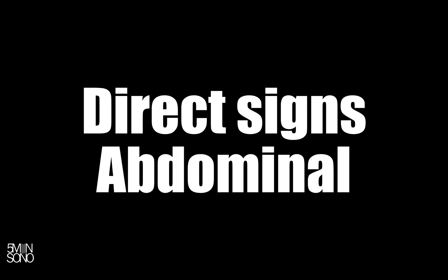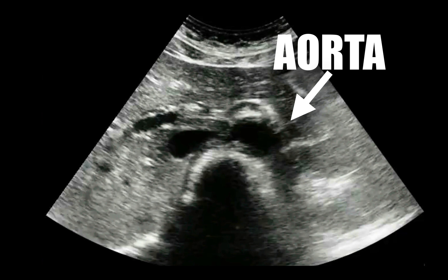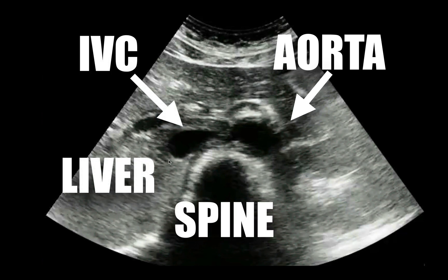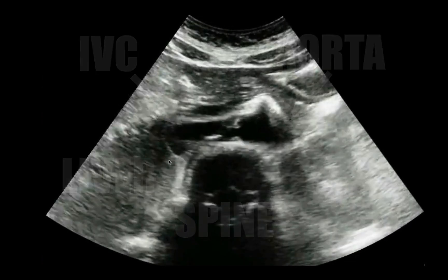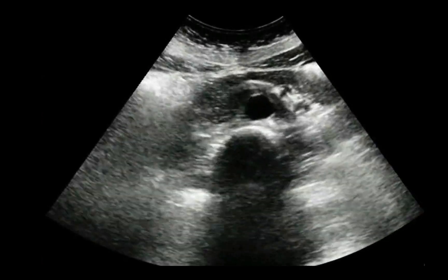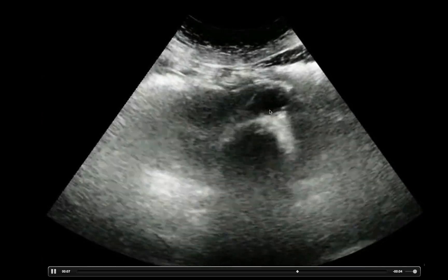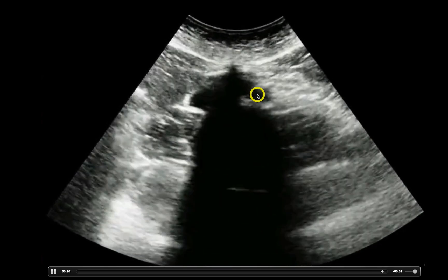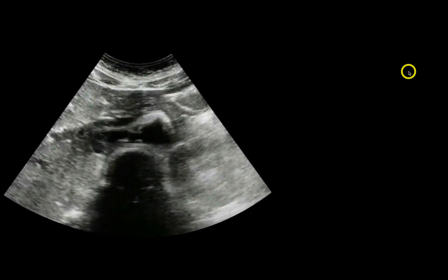Now let's talk about direct signs of an abdominal aortic dissection and review the anatomy. You're going to place the probe with the probe marker to the patient's right, and this is what you're going to see: aorta, IVC, liver, and spine with a spine shadow underneath it. You want to follow the aorta all the way from the epigastric region down until you get to the split of the iliacs — right there, splitting into those two iliacs. That's how you do an adequate evaluation of the aorta.